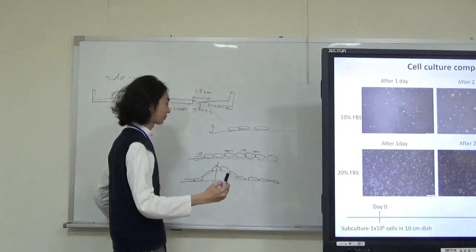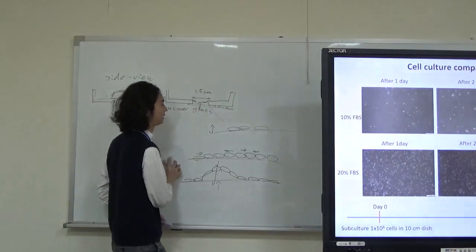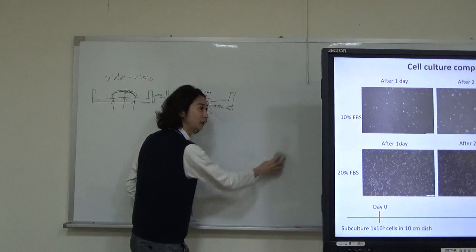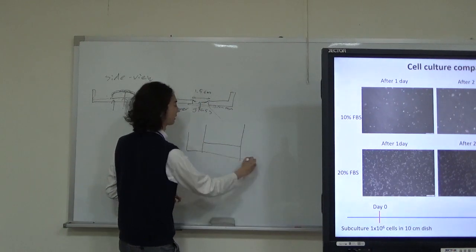Usually, researchers using Caco2 cells to model the gut need cell culture inserts.